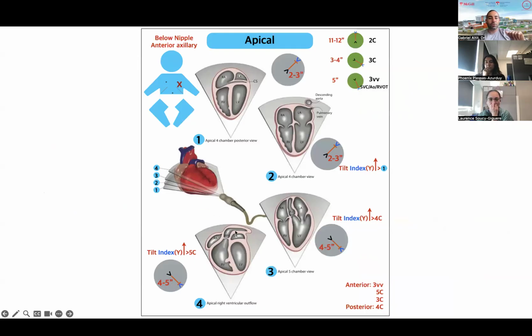In the four-chamber view, you can also angulate quite anteriorly and then get to see what we call the main pulmonary artery and your RVOT. I find that this is a good view once you get your first sweep to see the anatomical relationship. Make sure that your MPA is crossing your aorta, that you don't have overriding of any of your arteries, and that you don't see any VSDs, by putting a color on your septum.